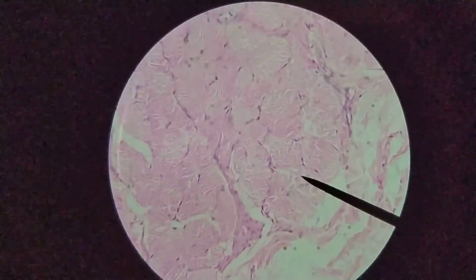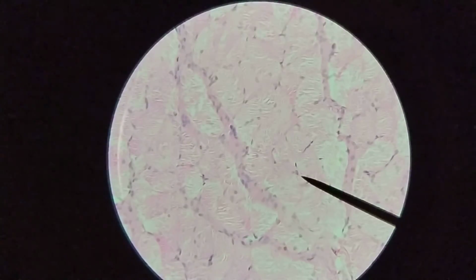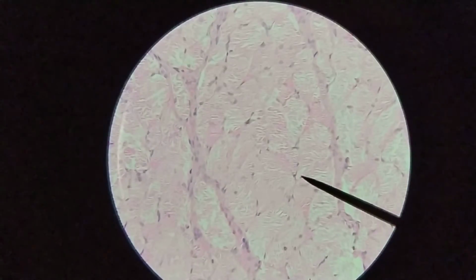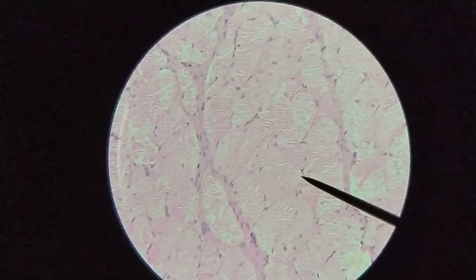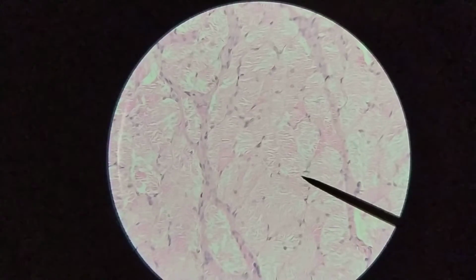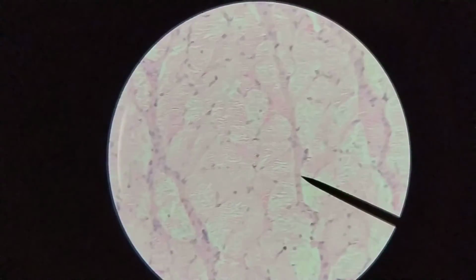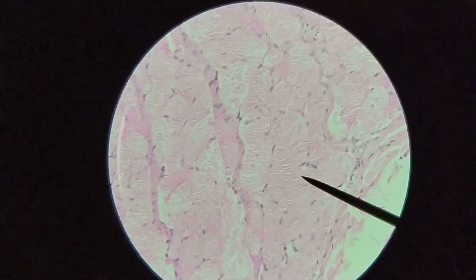As we go further, we start to see the muscle layer in the tunica muscularis. Again, we have an oblique section here, so it's not ideal. But we can make out the fact that we have peripheral nuclei. I think this was a little bit more obvious at the lower magnification, where you can see the outlines of these cells a little better.